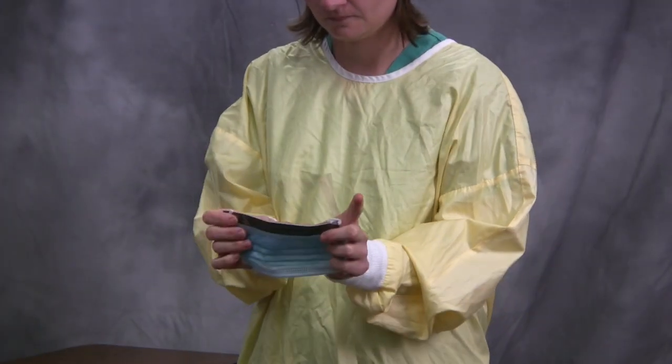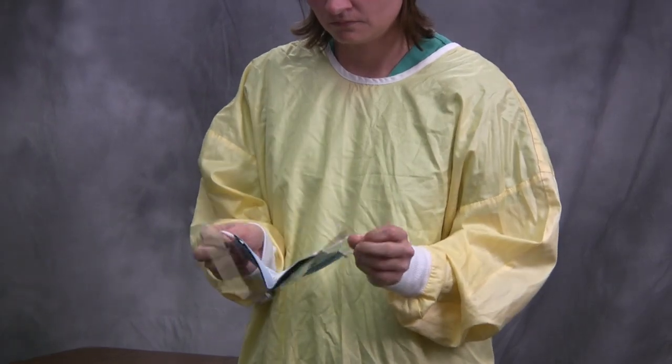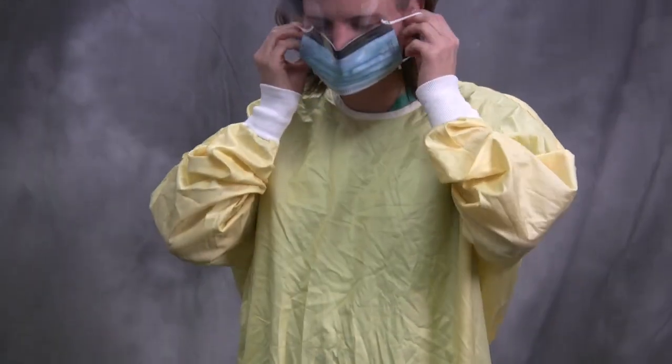Finally, ensure the mask is snug and comfortable on your face. Procedure masks also come with attached eye protection, and this mask is applied in a similar fashion.